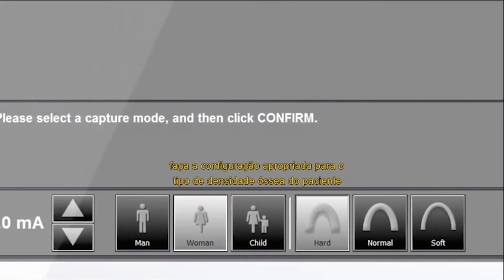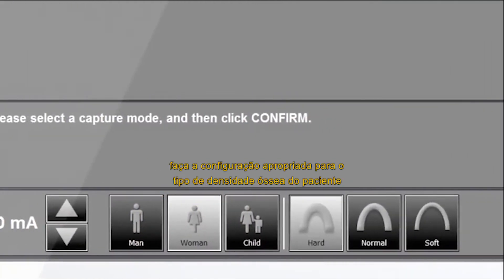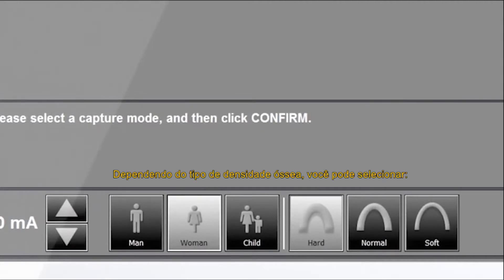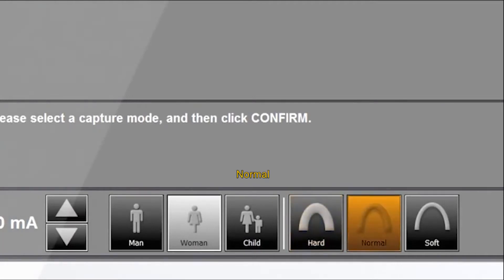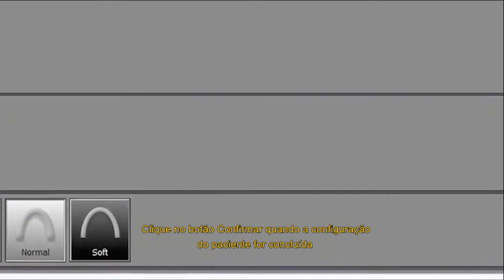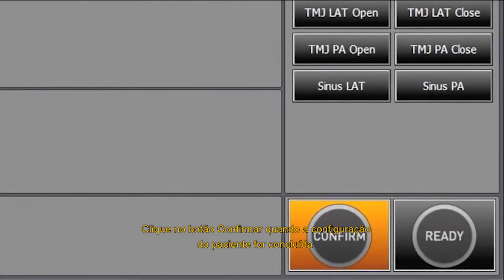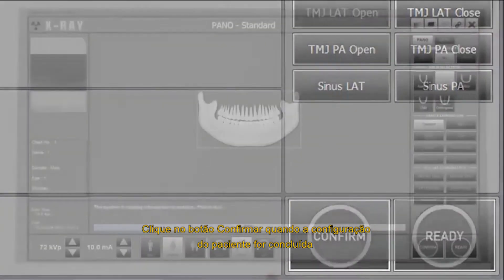Please select the appropriate setting for the patient's bone density type. Depending on the patient's bone density type, you can select hard, normal or soft. Click the confirm button when the patient setting is completed.